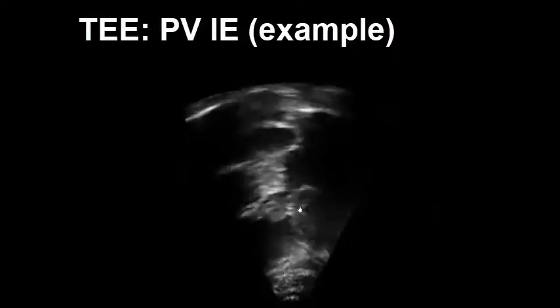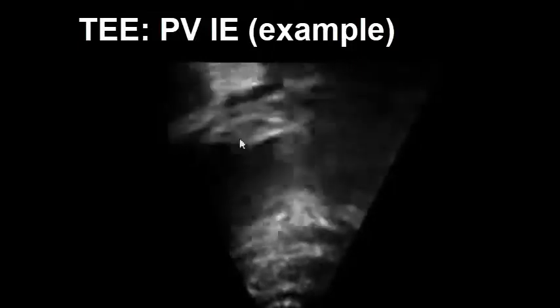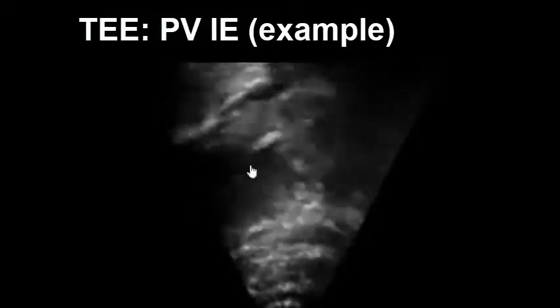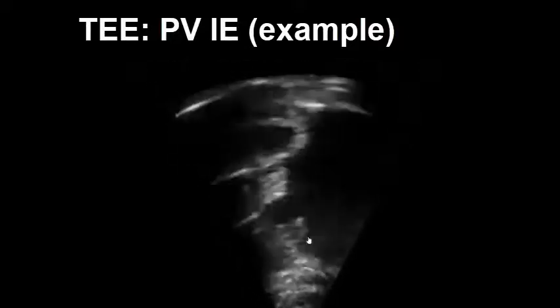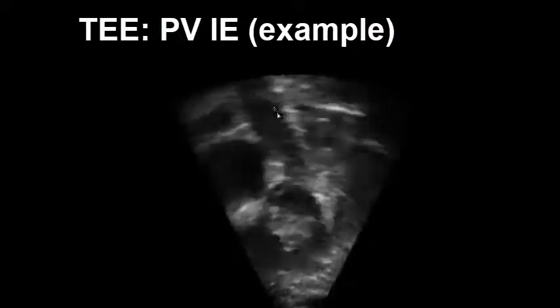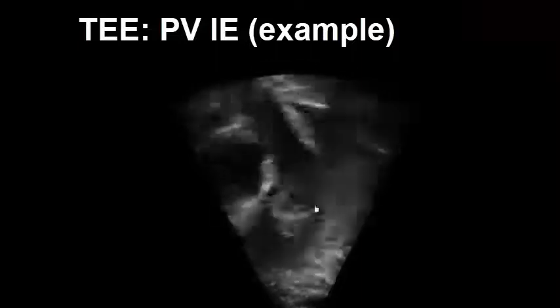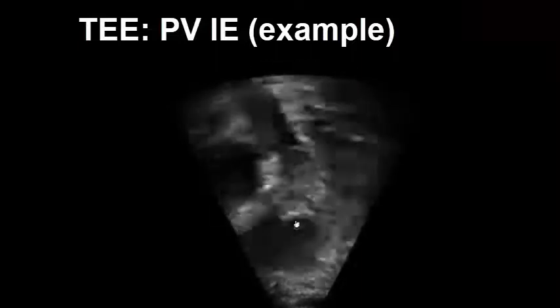We see an echogenic mass on the pulmonic valve itself, and zooming in, we see the mass more clearly with the RVOT immediately in front and the main PA immediately behind the pulmonic valve. And finally, we hone in on the main PA seen here going up the screen, and we can clearly see a vegetation on the pulmonic valve itself, with the risk of causing pulmonary embolism and septic pulmonary emboli.